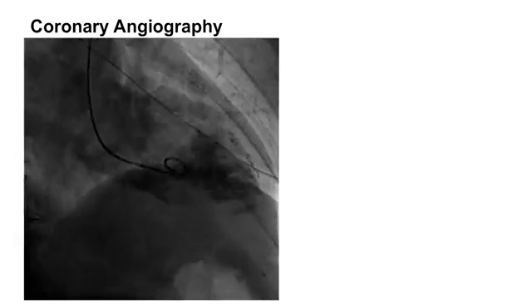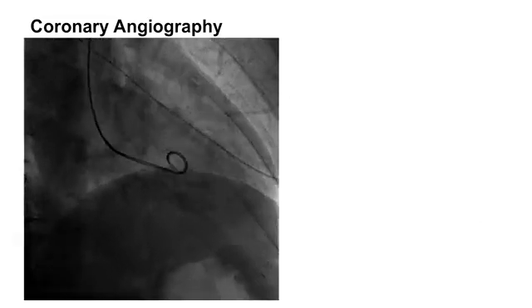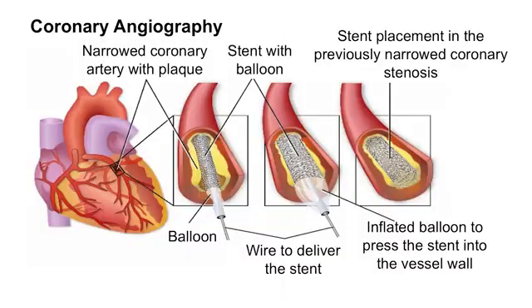Coronary angiography can show not only the coronary arteries themselves, but also other structures of the heart, such as, for example, the left ventricle, and show its motion. It can invasively measure pressures and gradients over valves, and it offers the possibility to treat a blocked artery directly.